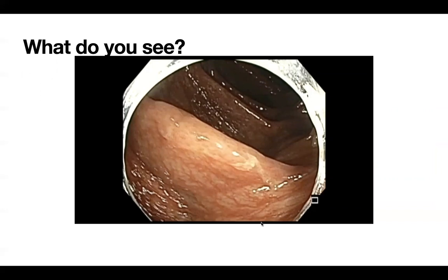And maybe that's one of the reasons that the endoscopist felt that, okay, this could be resected, but I'm not in a stable position. And if you're not in a stable position, that is a polyp that you should not resect, because if you resect, you're probably going to not resect completely. And the second one is if you resect and end up with either bleeding or perforation, you may not be able to manage that.